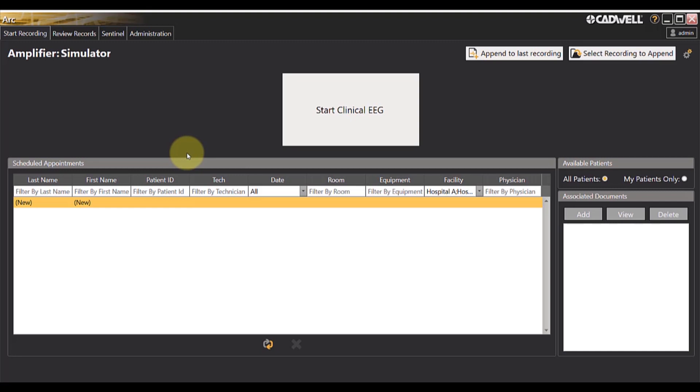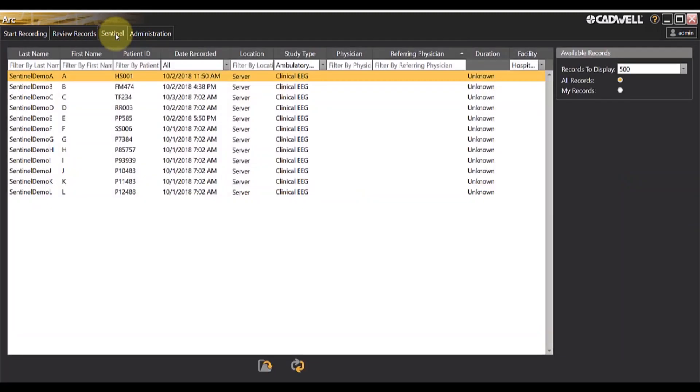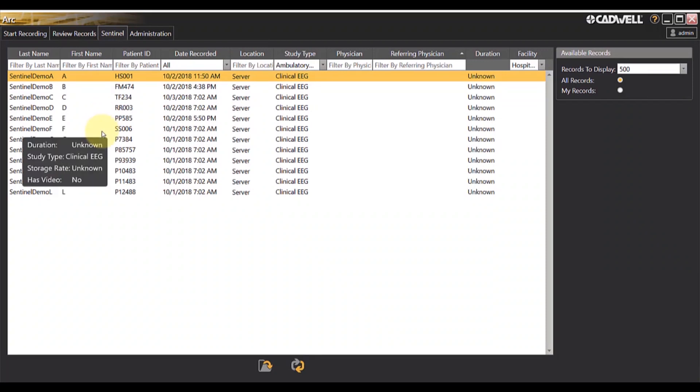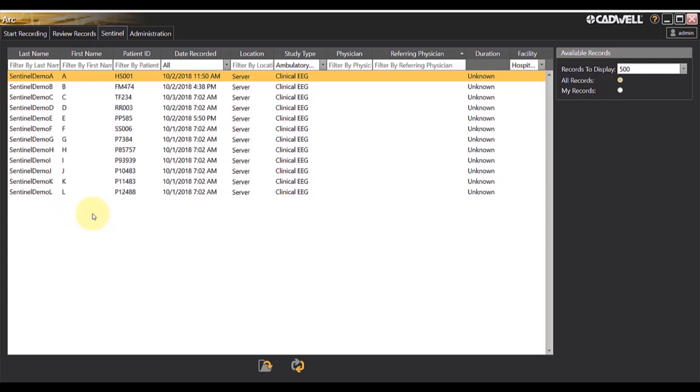If appropriately licensed, your Arc software will have a Sentinel tab available. Clicking on Sentinel will allow you to see all of the active patients recording, and you can choose which patients to add to your Sentinel monitoring.